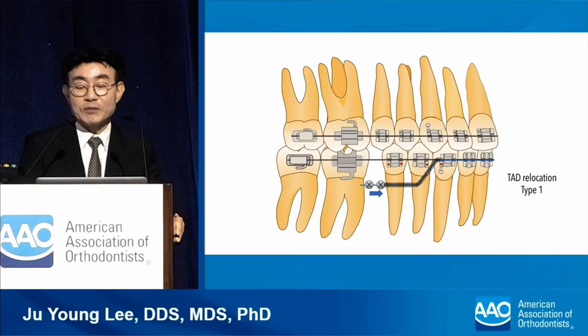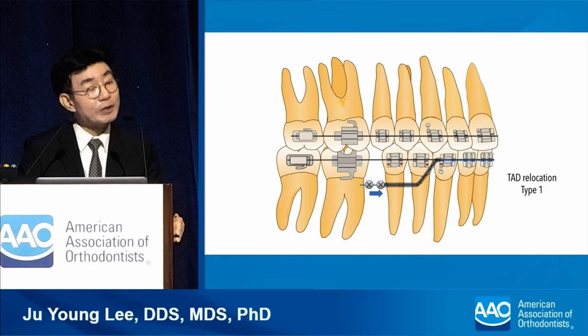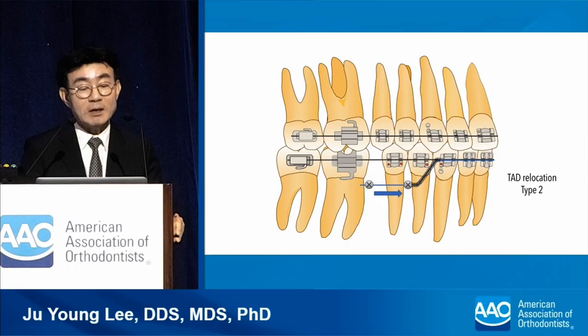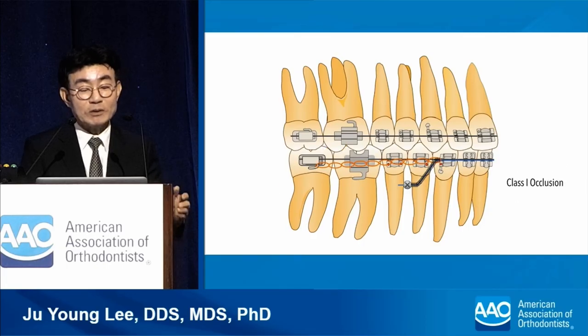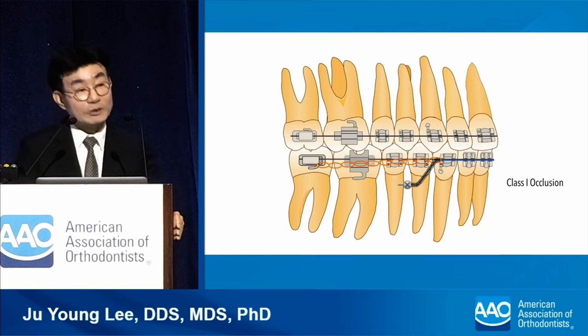If the TAD interferes with the movement of the posterior teeth, the TAD should be repositioned anteriorly. At this time, it can be moved just behind the premolar. Alternatively, it may be installed between the roots of premolars that have already been moved to the desired position. After using the open coil spring to firmly hold the canine to the repositioned TAD, the posterior teeth are moved forward. Following the protraction of the posterior teeth, the class 1 occlusal relationship was achieved.